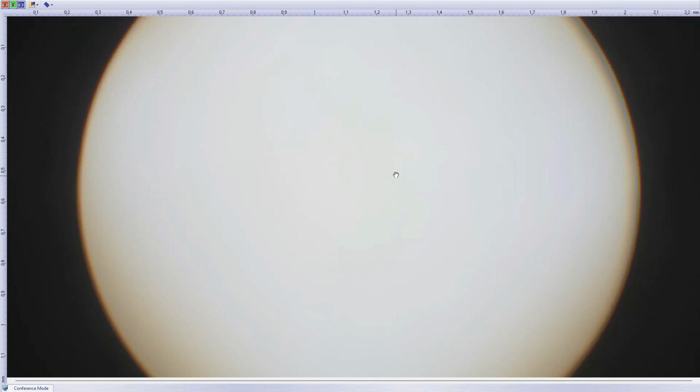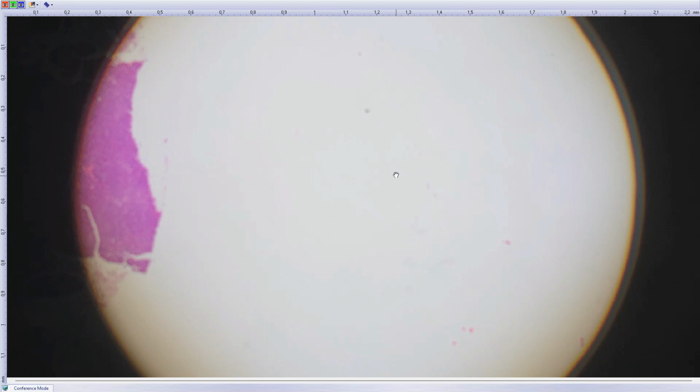So, good afternoon to everybody. I have just one entity, probably either the same entity or a very similar entity occurring across various organs. The first example is from the pancreas.